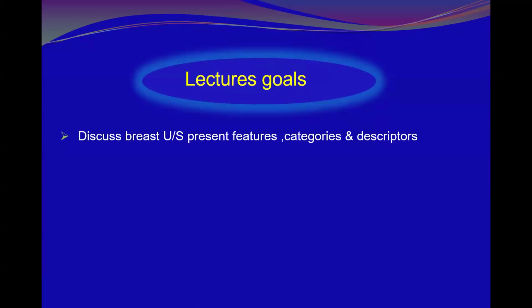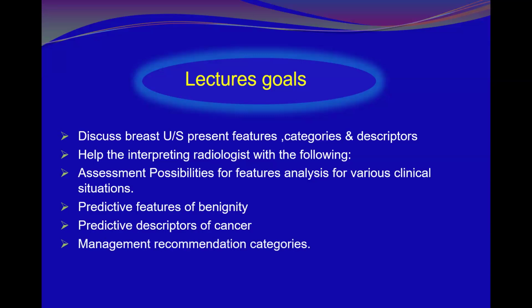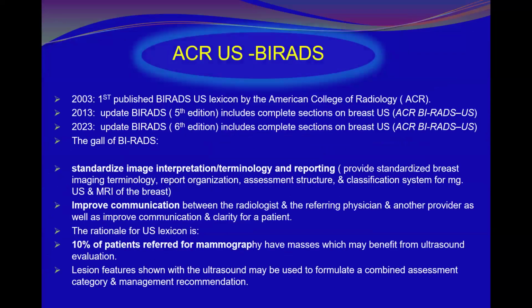Our lecture's goal is to discuss breast ultrasound features, categories, and descriptors, to help the interpreting radiologist with the following: to assess possibilities for feature analysis for various clinical scenarios, predictive features of benignity, predictive descriptors of cancer, and management recommendation categories, as well as management of certain clinical scenarios throughout the series of the lectures.